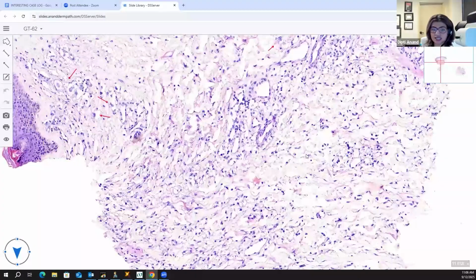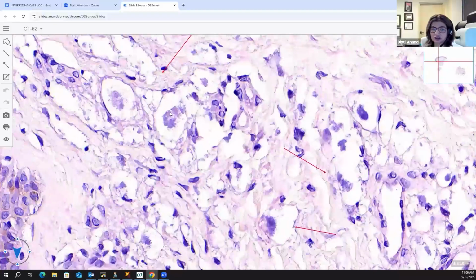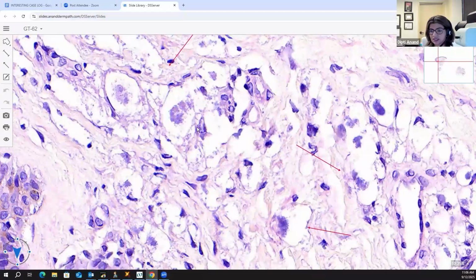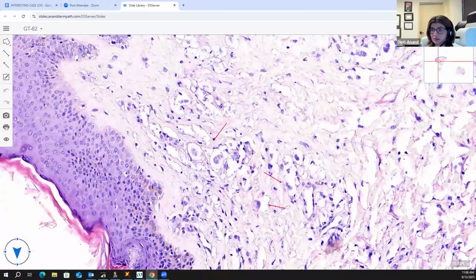But what the histiocytes have inside them is very different. The histiocytes have these fluffy bacteria in them. These are called globi. So lepromatous leprosy, you probably don't even need to stain it because you can see the bacteria. Yes, we will obviously stain it. We will do a Fite stain to confirm that these are Mycobacterium leprae organisms, but you can see these globi, these large cells with these fluffy bacteria in them. So looking inside what is there in the cells is important. So this is an example of lepromatous leprosy.